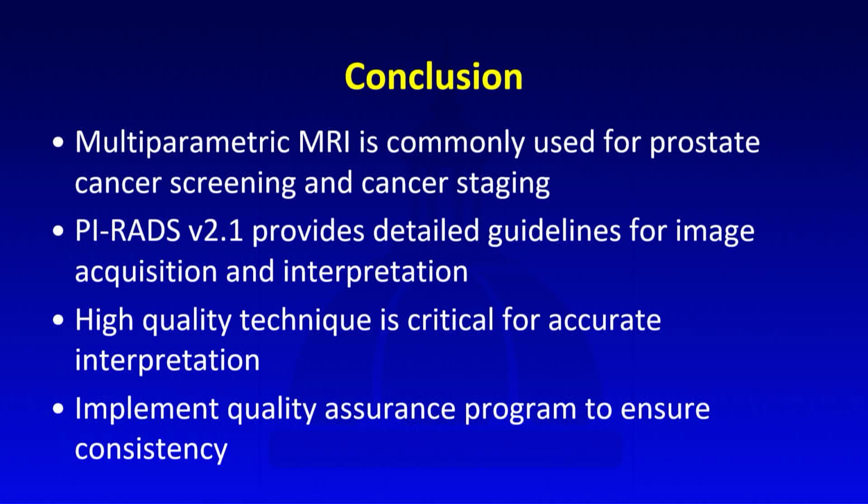I would say the only way to get better at prostate MRI is really to get feedback. We recently implemented a system in Epic in which it pulls out reports with the pathology so that the radiologist can really learn from that feedback. And I think if you're going to read prostate MRI on a high volume basis, having that kind of feedback mechanism is critically important.